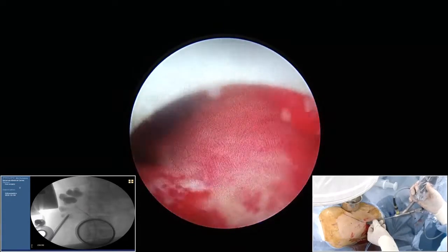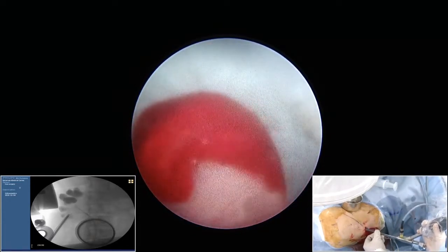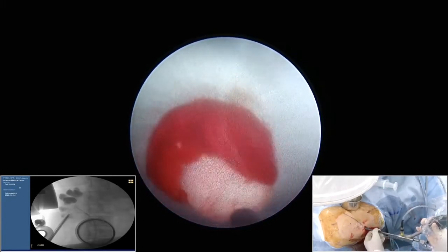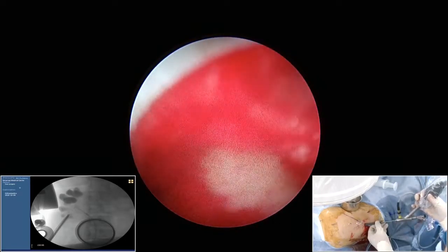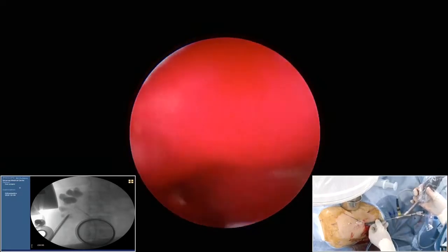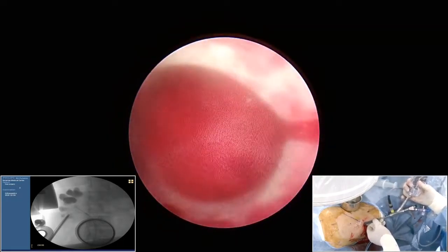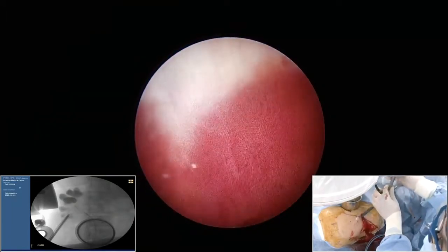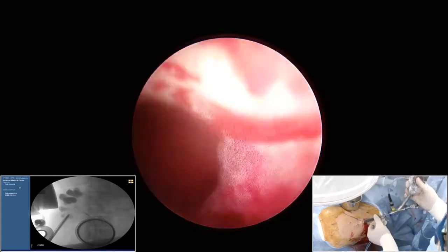I think that is a very wise decision. And it demonstrates that one has to be flexible during surgery. If you cannot reach it straight, one good piece of advice is not to bend the sheath inside the kidney too much. Otherwise, you can do some forceful harm to the kidney and you will cause bleeding. That's also true.